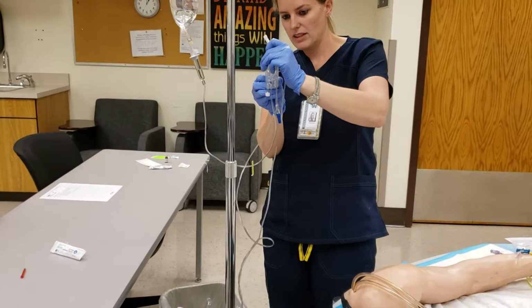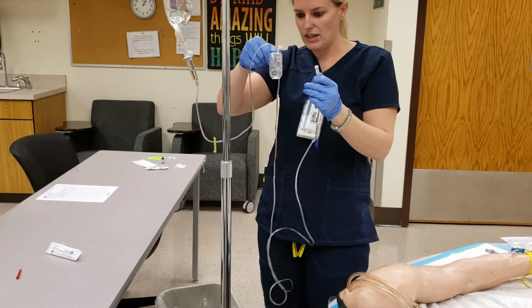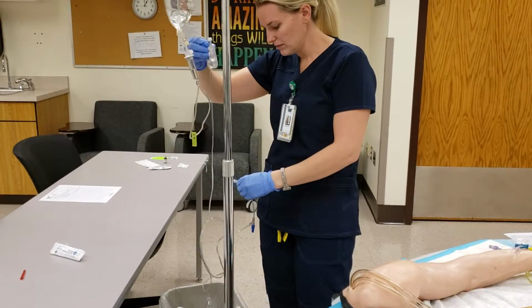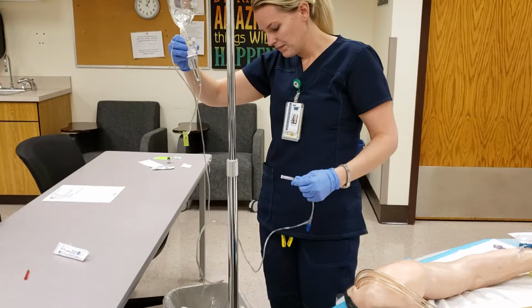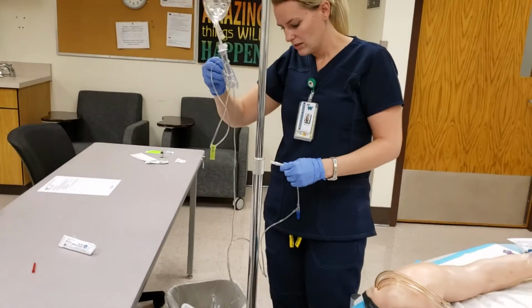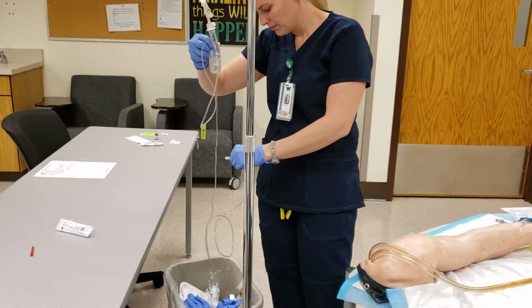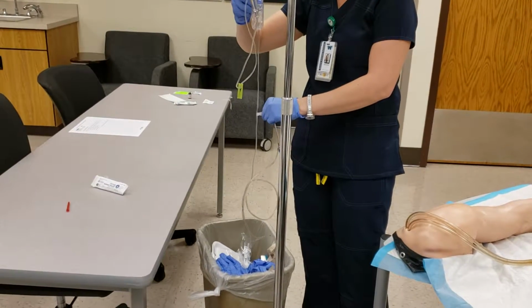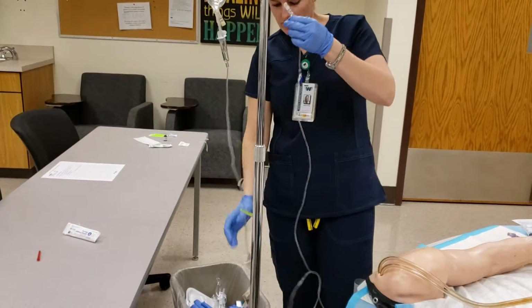So I'm going to open this. Once the side is filled, we're going to flip it. And we're going to make sure we get all of the air bubbles out. Bubbles are out, so this is ready to go.